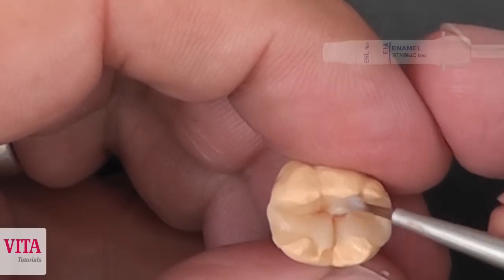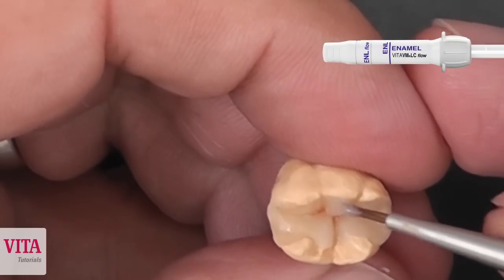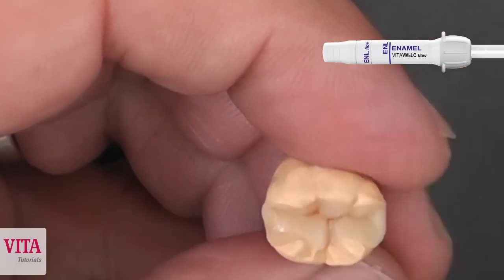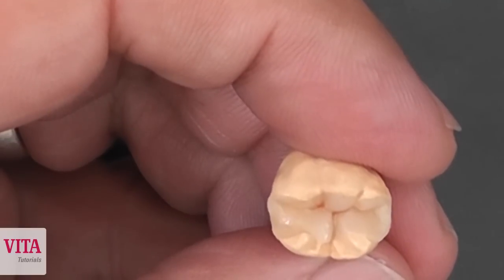After the fissure staining, we start layering our enamel for our approximate ridges and our approximate contact areas.